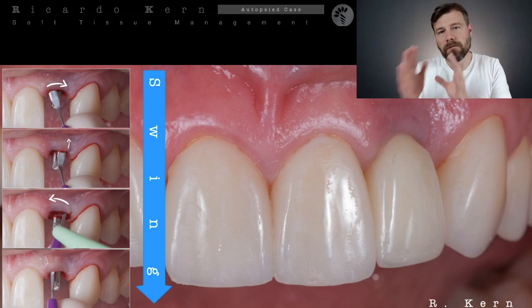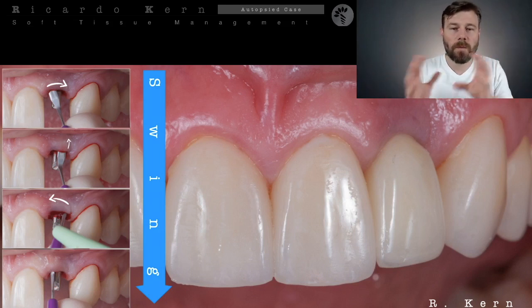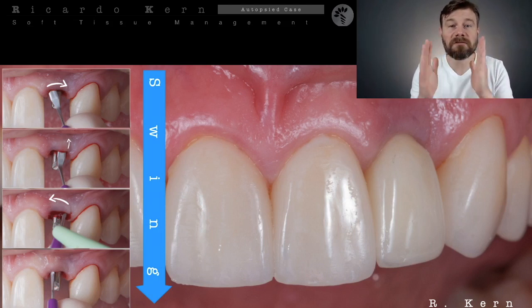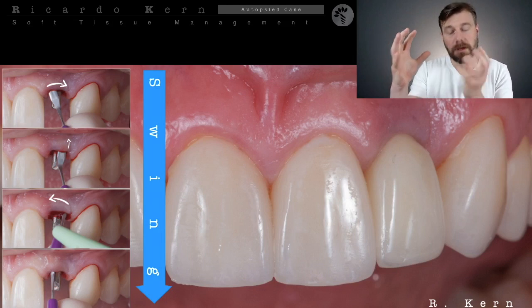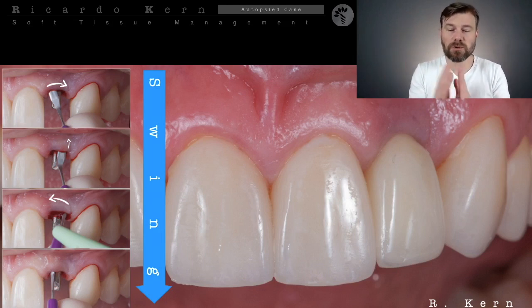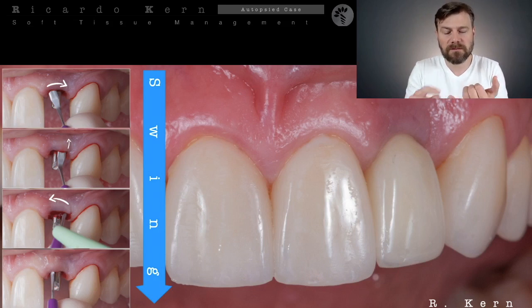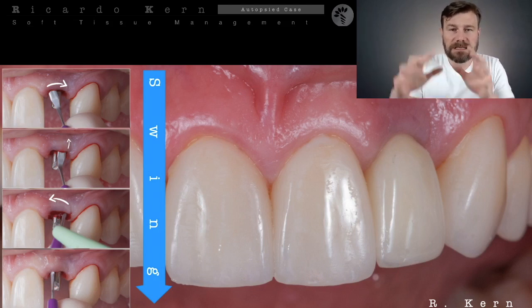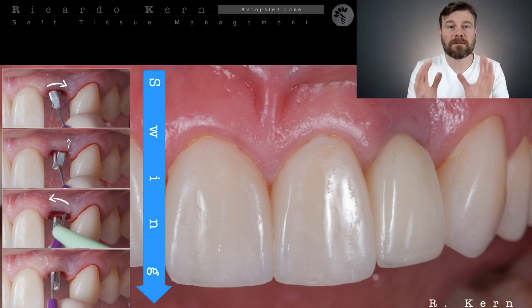What is for and what is against one of these options? Every time that you go to a full thickness flap, you're going to leave more thickness on the flap. So when you go inside with your connective tissue, usually your flap is stronger and has more chance to survive, because you preserve the periosteum, all the blood flow, and all the tissue arranged and perfect to endure, okay?